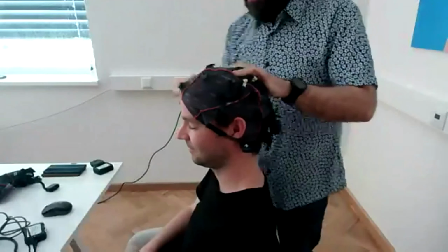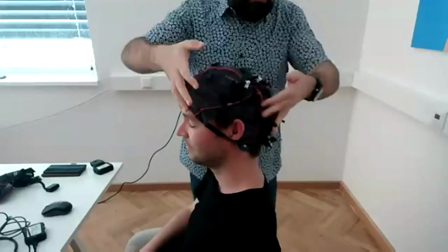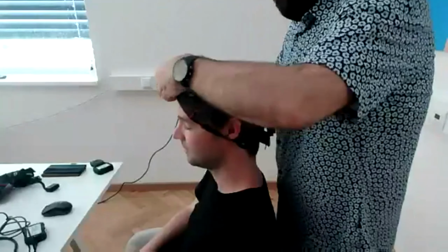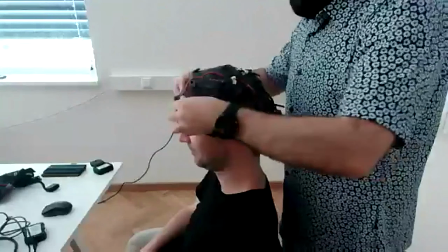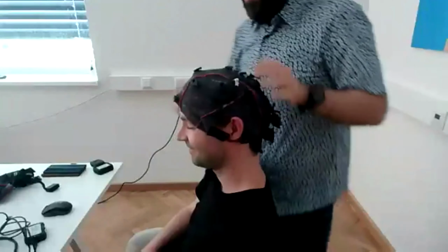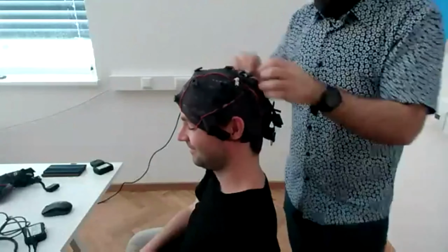So I'm measuring, like I said, for the montage, the difference between the inion and the nasion. And the Cz should be then a bit more to the front. Sorry, Matthias. It's good enough. So the Cz here is fine.